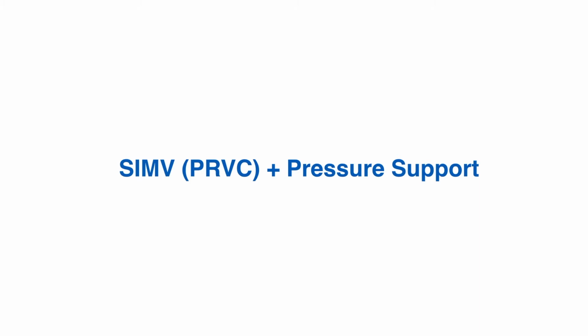So every breath the patient takes on this mode of ventilation gets some support. The number that you've set with the respiratory rate get big breaths, but any breaths the patient takes above that get a small amount of support in the pressure support breath. And what you tend to do with the pressure support breath is you pick a pressure above PEEP that you want the patient to get.